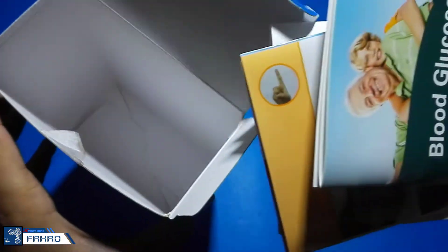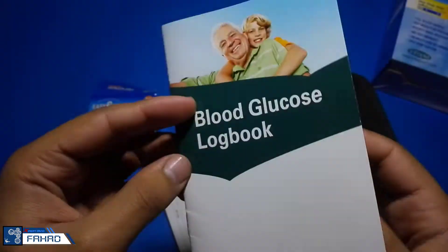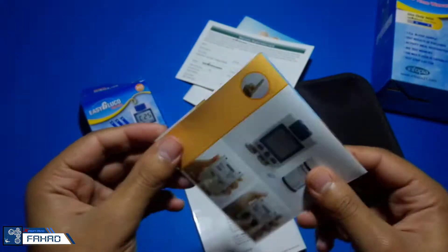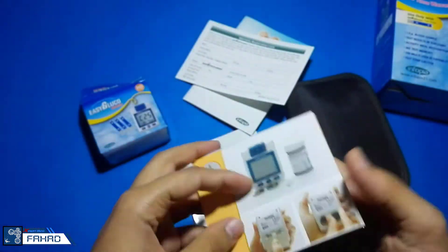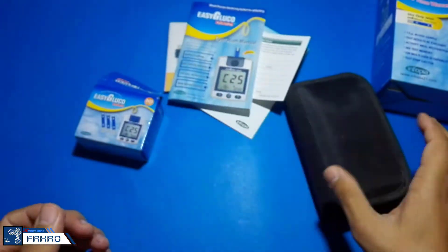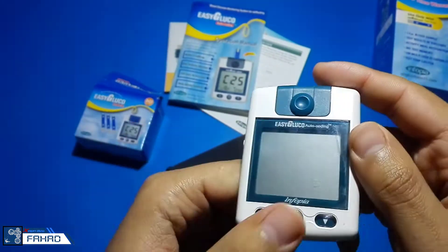Let's see what these books are. Here is a log book where you can write your daily sugar level or record each time you check. And some kind of manual book. And now this is the glucose meter.